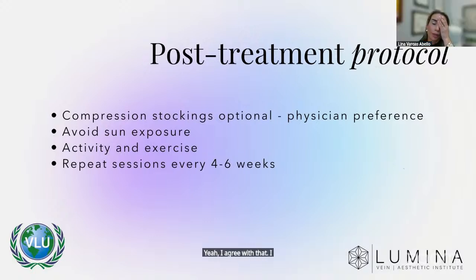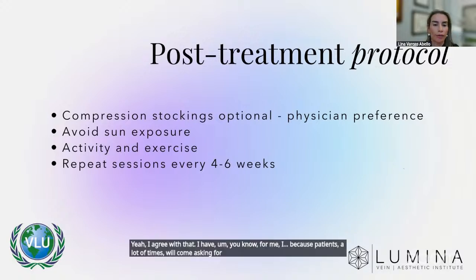Yeah, I agree with that. A lot of times patients will come asking for laser because they're afraid of the needles, or whatever it is. And so it's whatever I think is going to be best for them. I have the laser, I have a 1064, I have an IPL, I have all of these things, but I charge exactly the same because I don't want them to decide on one versus the other because of their fears or what they're going to pay. I just want to be able to offer what I think is going to be best for them.